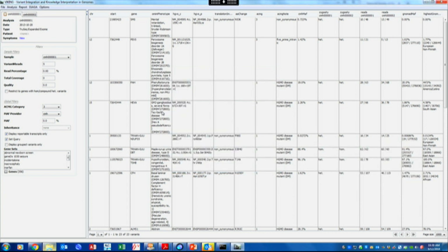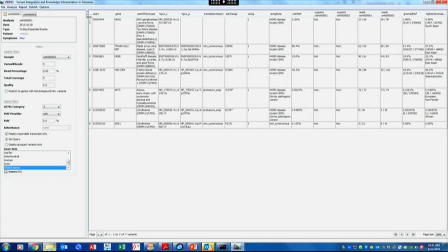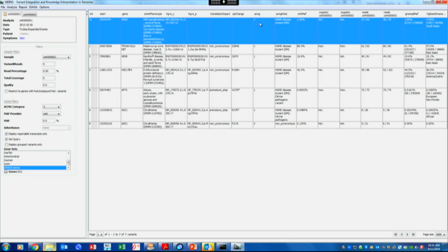Okay, so this should be a little bit more restrictive. Okay, so now only 7. These girls are school age, maybe around 7, so they're probably less likely to have Tay-Sachs, and this is a plus 30 variant, so that's pretty deep in the intron. We wouldn't even report that, but we would investigate it if it's a category 1, because there are splice variants very far out in the intron that have been reported. So you just need to go down the list like you did yesterday and correlate the features of your patient.